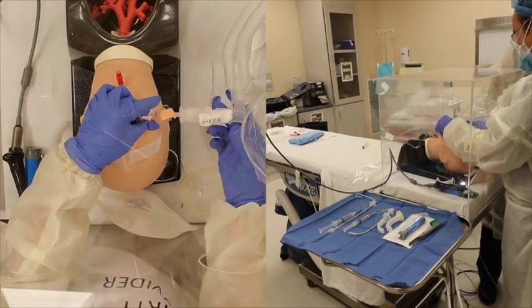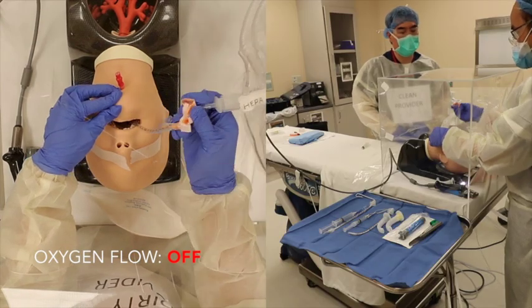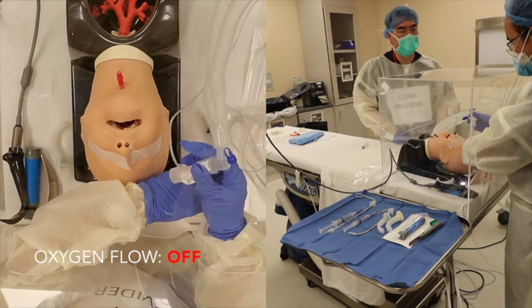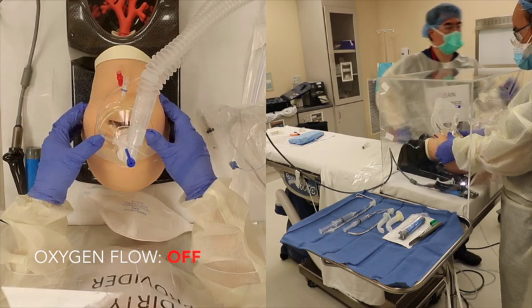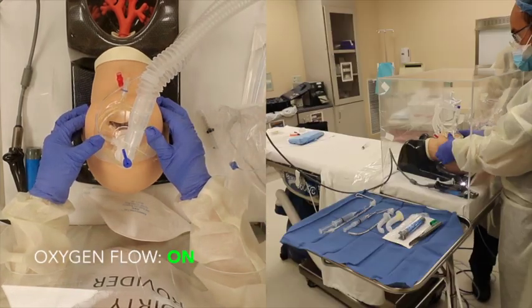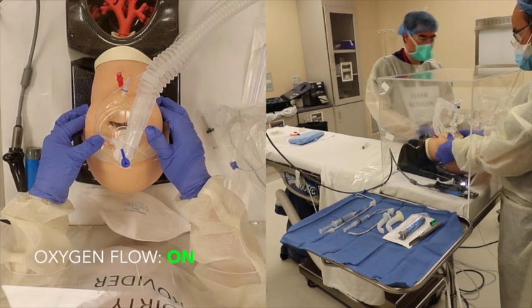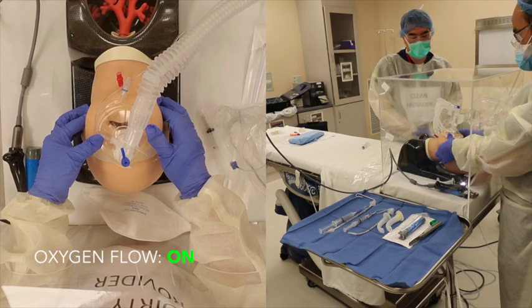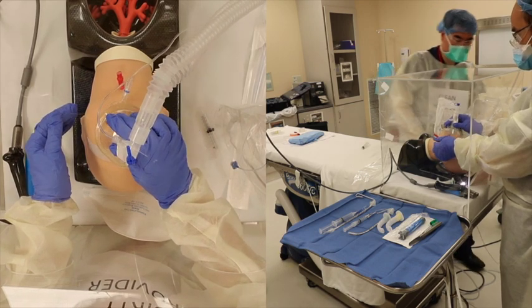When ready to extubate, the assistant will turn the flows off. The operator will extubate and discard the endotracheal tube. Once extubated, apply the face mask and tell the assistant to turn the oxygen flows back up. Use low flow oxygen and monitor the patient using standard monitors for the remainder of the emergence. Keep the airway box on as long as possible until leaving the operating room to minimize contamination during emergence.